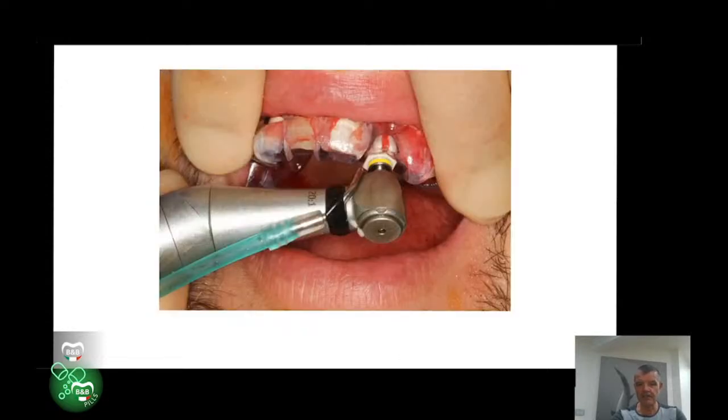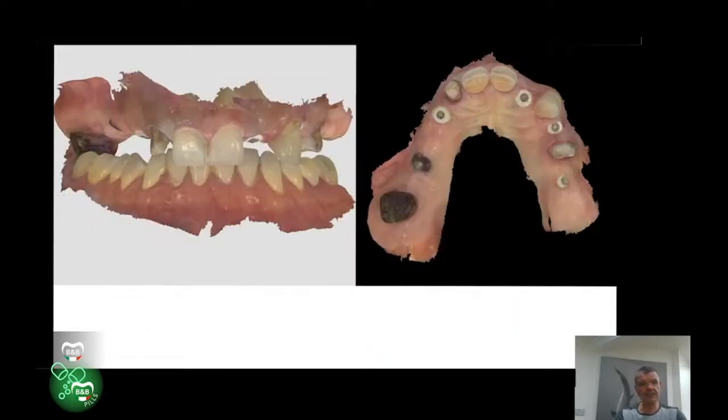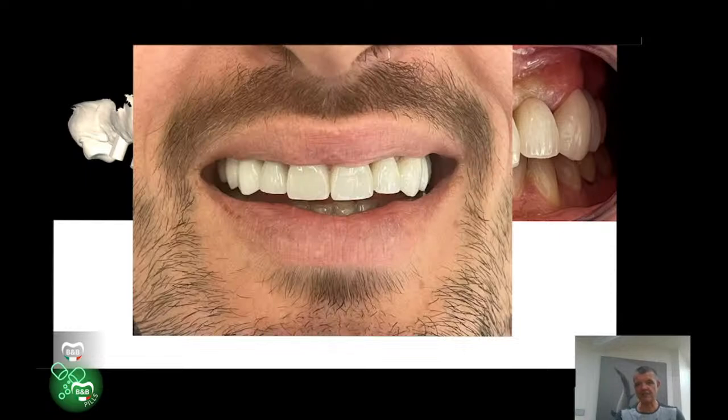So we were then able to place all 5 of the implants really very efficiently, obviously using a little bit of sedation for this guy, but we got through the surgery fairly quickly, fairly uneventfully, got the 5 implants into place, as you can see here, all in less than 40 minutes or so for him. So after healing, this is how the Trios scans looked, and we were then able to pop the scan bodies in and scan the implants. And this is the restorations as they looked at try-in just a few weeks later, and that was the finished result. So really, it was all done very, very efficiently for this chap, and he now thinks that we are just the best practice ever. So that's how we managed him.